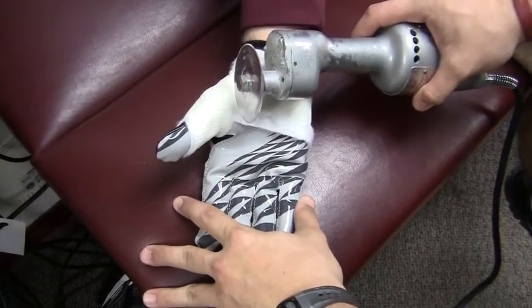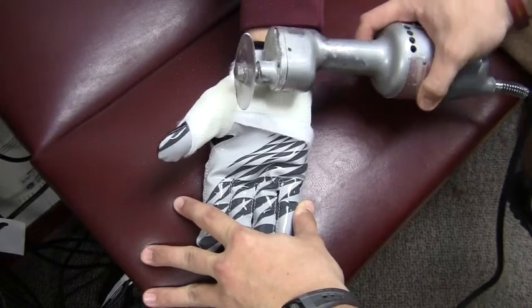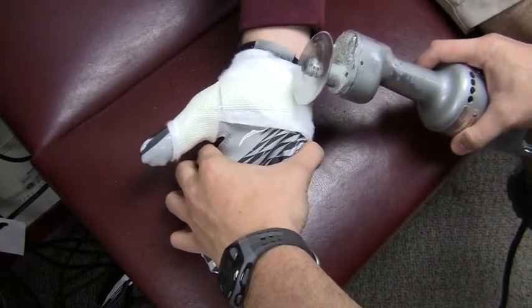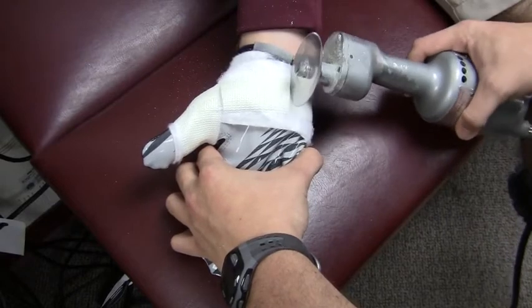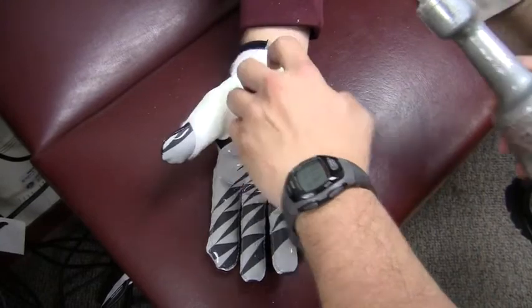Make 2 cuts on the palmar surface of the cast. 1 cut should be just inside the thumb joint, and the other should be made just medial to the outside of the hand. Be careful not to apply too much pressure with the cast saw to avoid causing any discomfort for the athlete. Rotate the cast saw when you are making these cuts to prevent overheating.